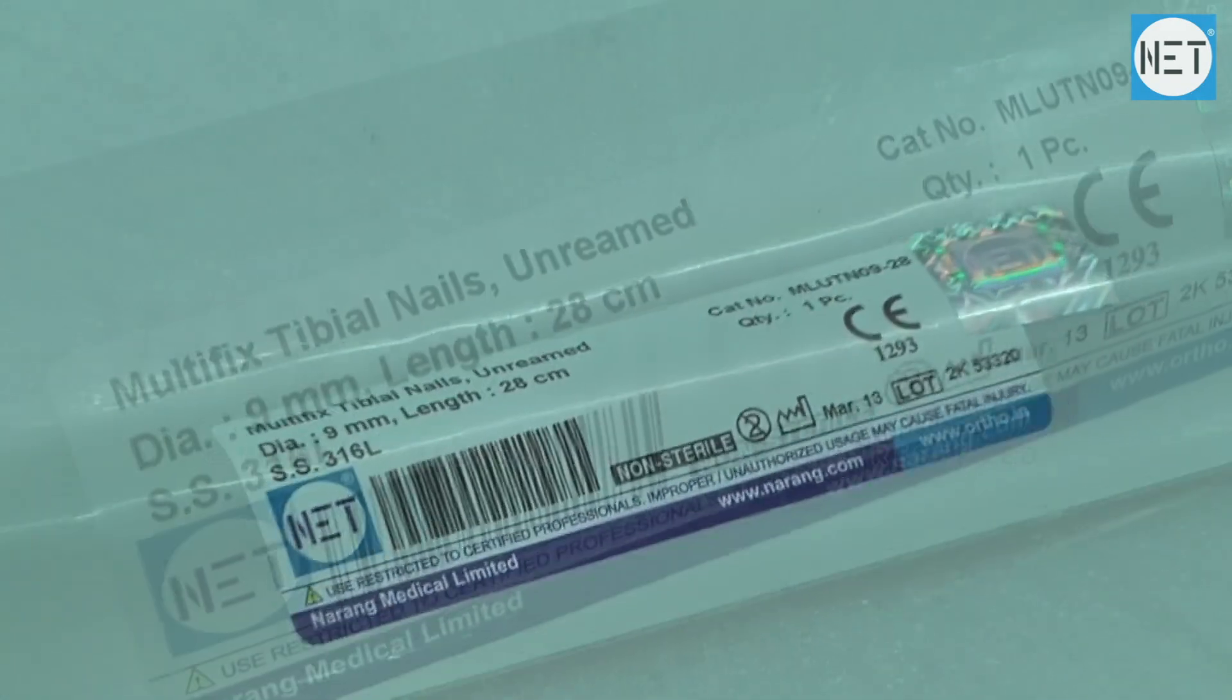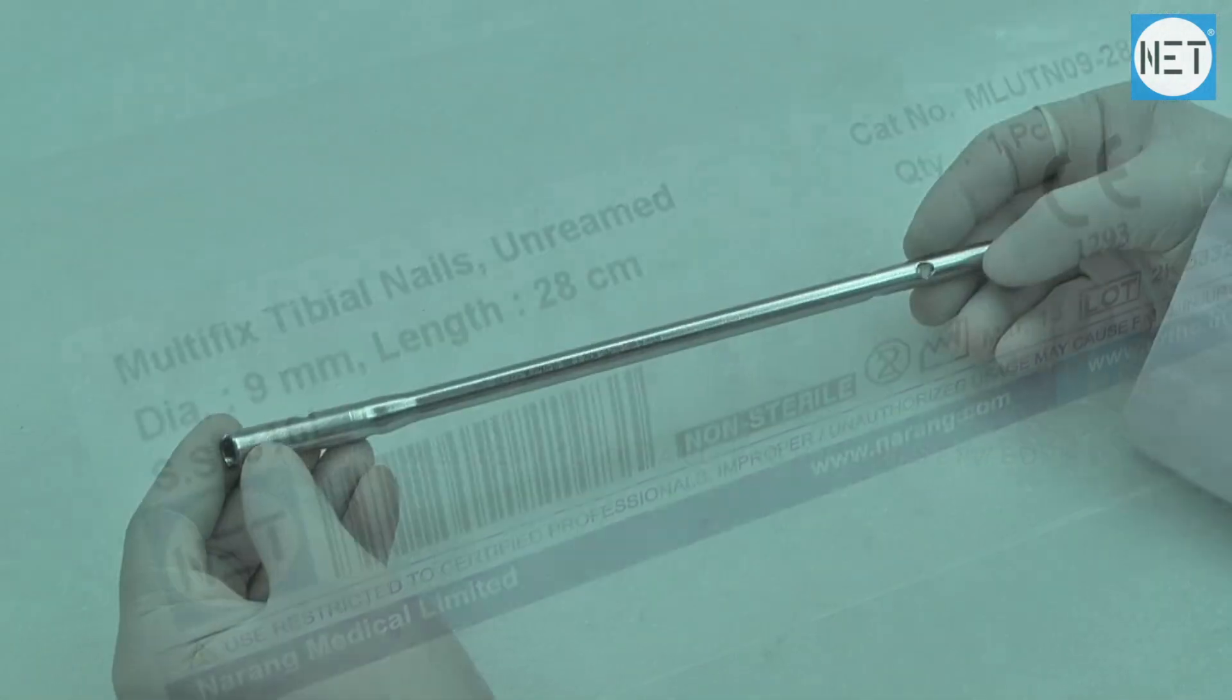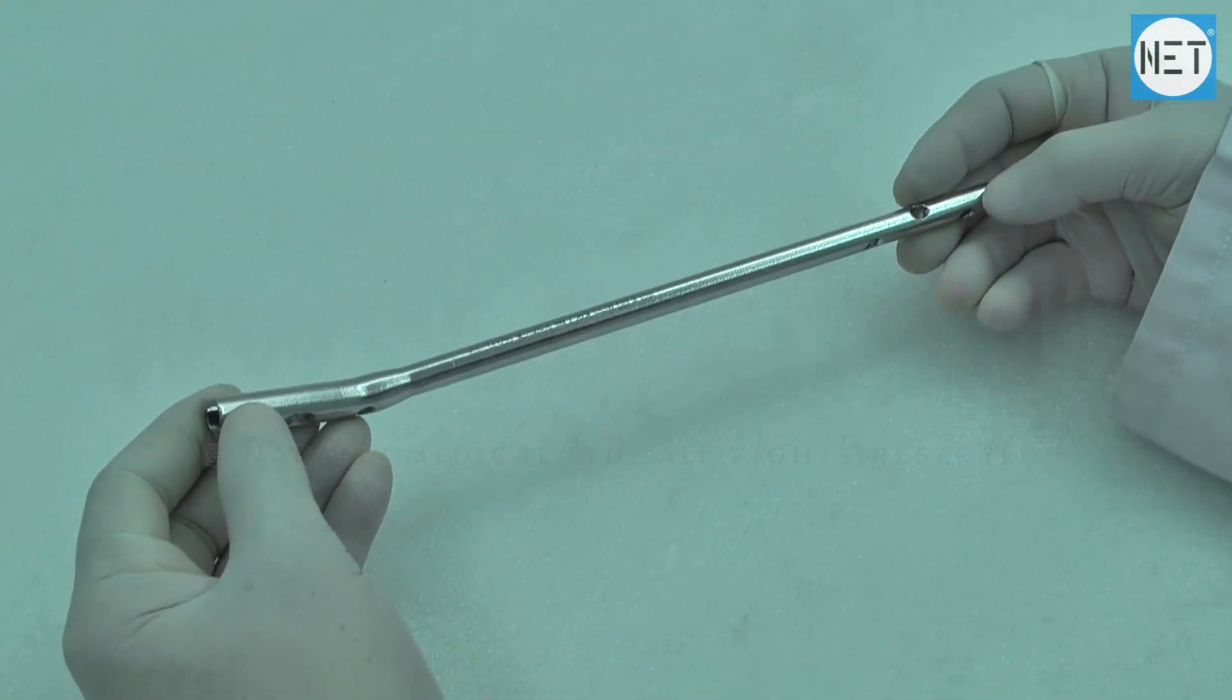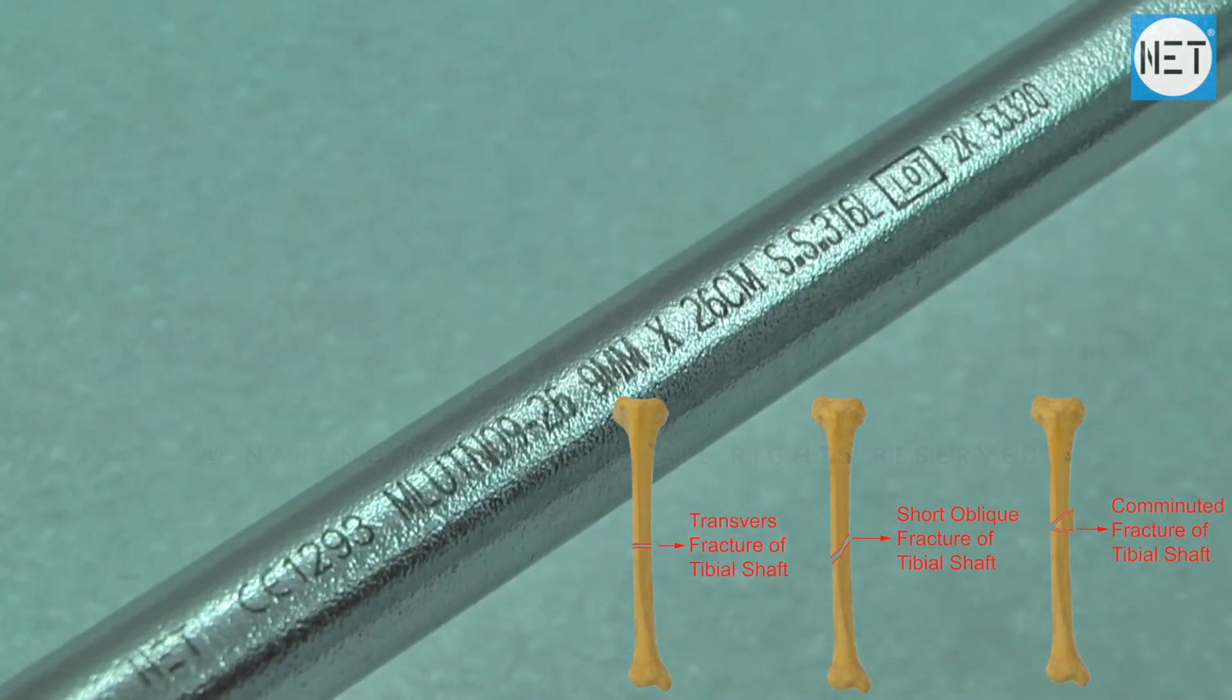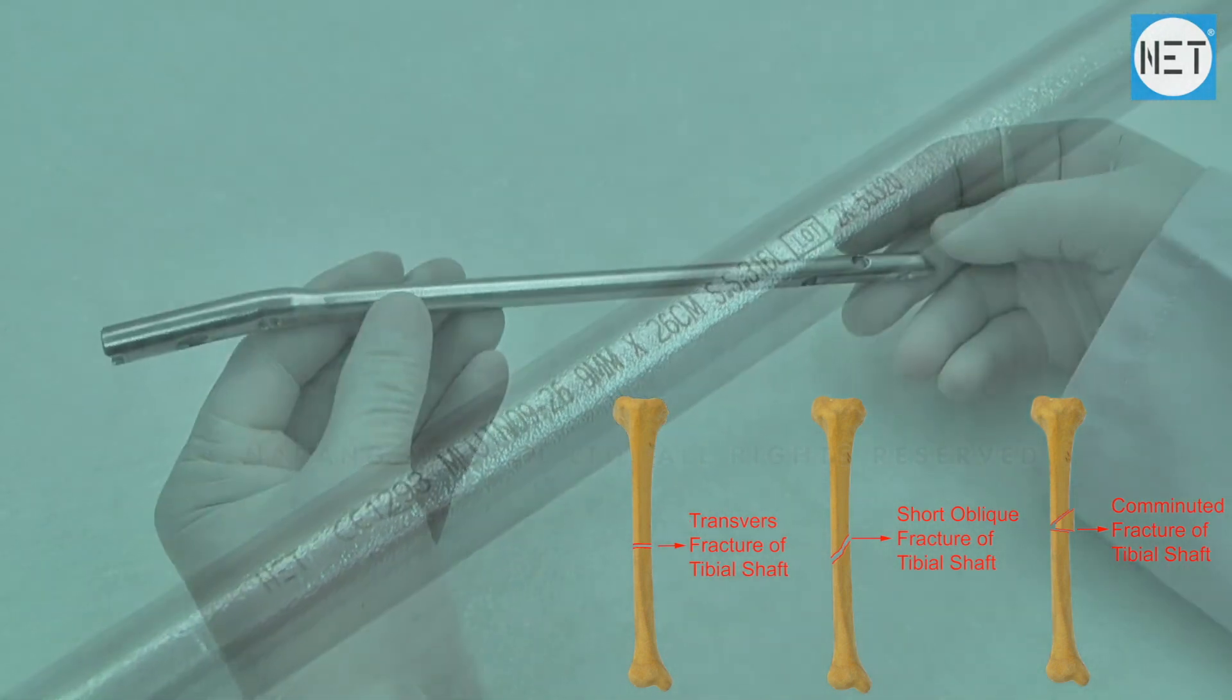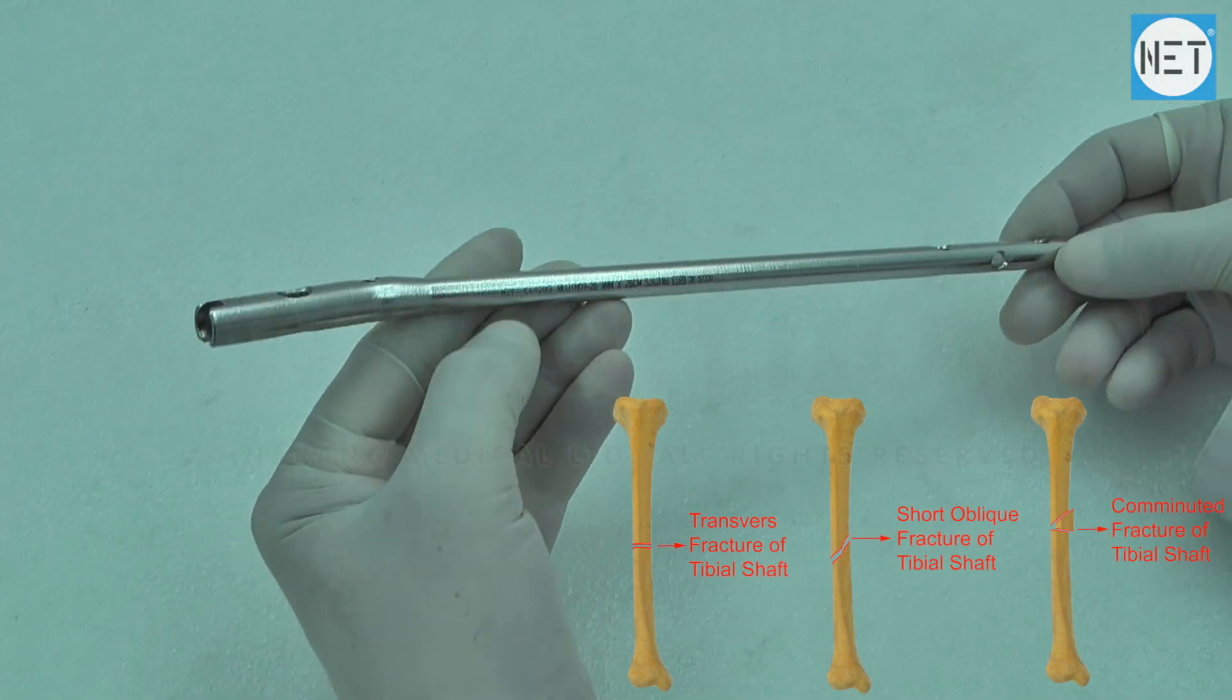Knit brand multi-fix tibial nails un-ringed dynamic hole. These nails are intended for fixation of open and closed, transverse, oblique, spiral, segmental and comminuted fractures of tibial shaft.